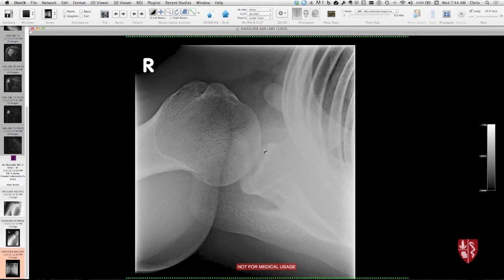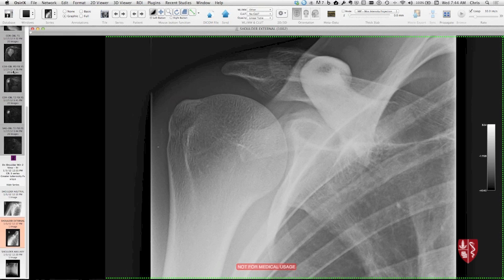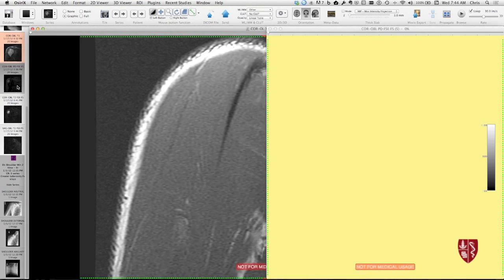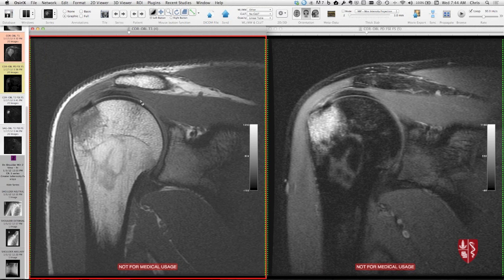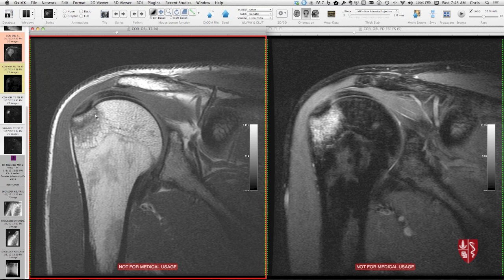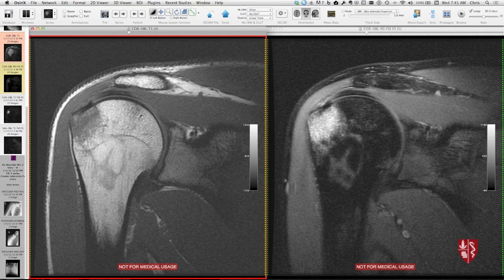On this axillary view, it's normally located. Here's the glenoid, humeral head, greater tuberosity here, lesser tuberosity here. I wanted to show this case because I missed it. If I show an MRI that was done a couple days later — here's coronal T1 and fat-suppressed proton density images — here's the humeral head, glenoid, supraspinatus tendon coming out to insert. What you can see is in the humeral head at the greater tuberosity, there's abnormal low signal on T1 corresponding with bright signal on T2, and here you can see a little bit of a low signal line. So that's a fracture line. This is a non-displaced greater tuberosity fracture.